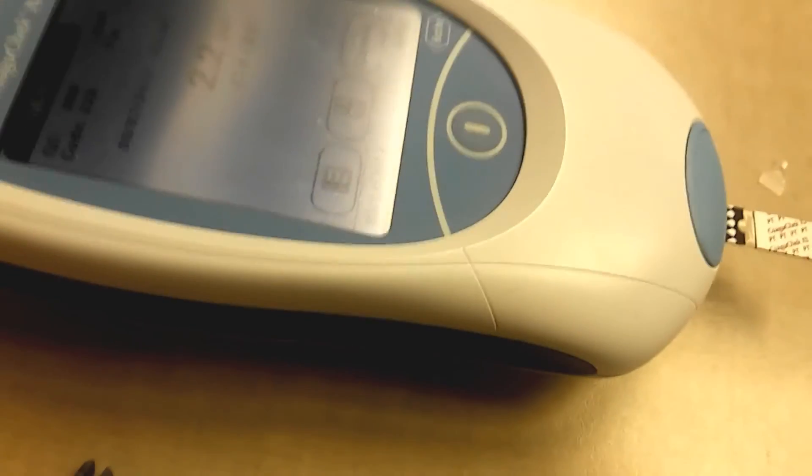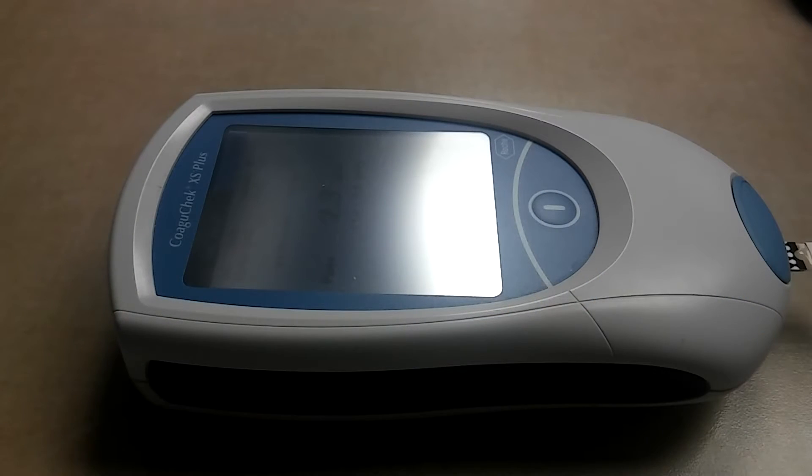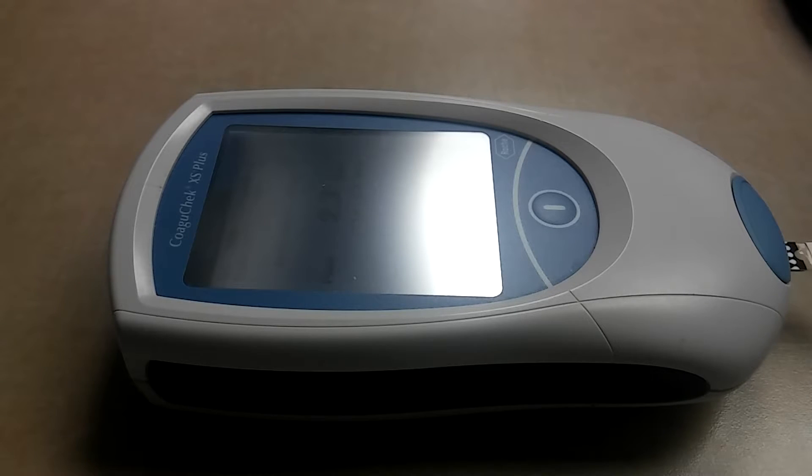Now if this was a patient, the only difference would be instead of clicking Control Test, you would click Patient Test. You'd have the waiting period while it loads and add the strip just the same. While everything's getting ready, you can prep the patient's finger by cleaning it with an alcohol swab, letting it dry, and then puncturing it with the finger lancet. Then apply the first drop onto the same area where we applied our QC, and it will give you a reading just the same.